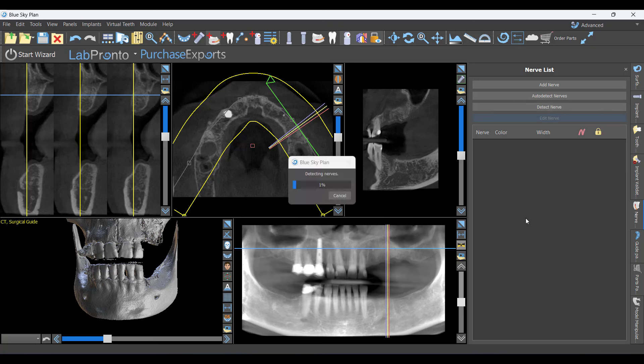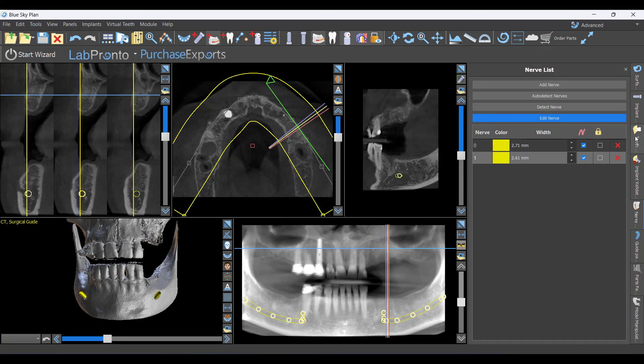Very quickly we've got a couple of nerves mapped in the case. Just like with STL stitching in Blue Sky Plan, it all happens automatically now and it's extremely reliable — but always verify it. You don't want it to have missed an area, automatically trust it, and then end up hitting a nerve because you never verified anything.